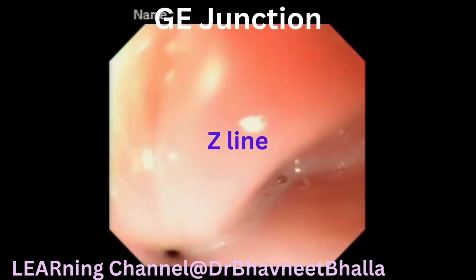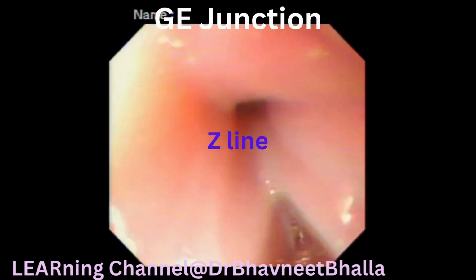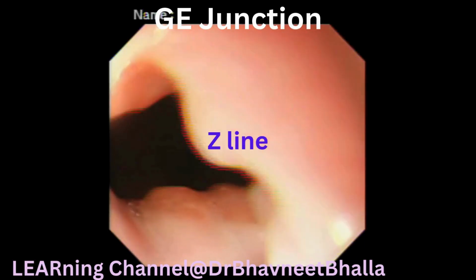At around 38 to 40 cm, you will be approaching the GE junction, which is marked by the upper end of gastric folds. The squamo-columnar mucosal junction is represented by the Z line.